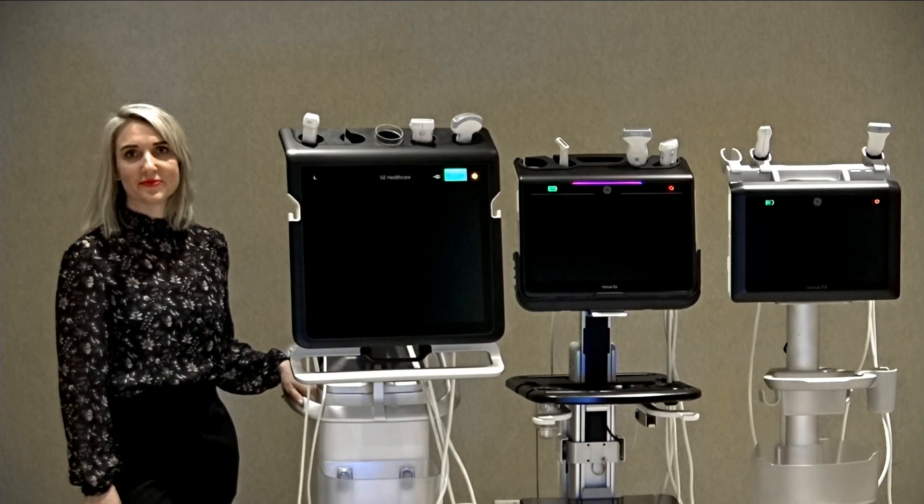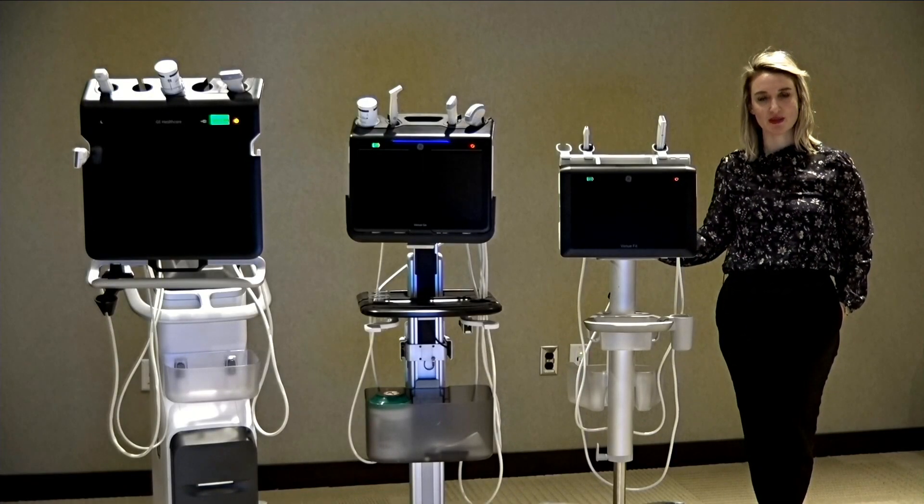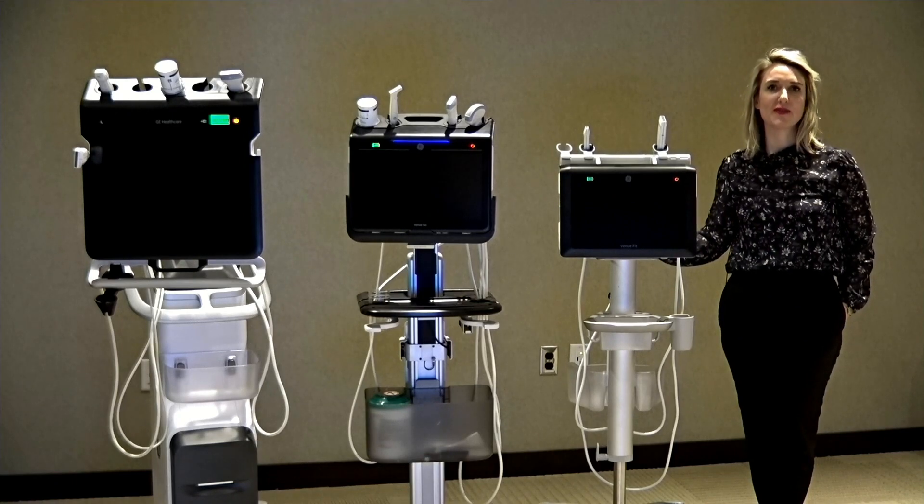Let's get started. The Venue has a 19-inch monitor, the Venue Go has a 15.6-inch monitor, and the Venue Fit has a 14-inch monitor.